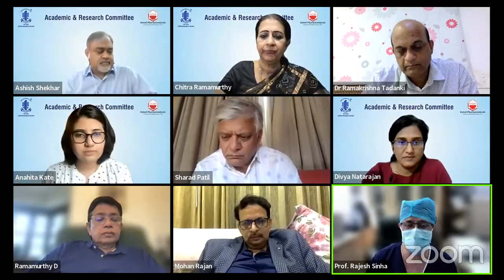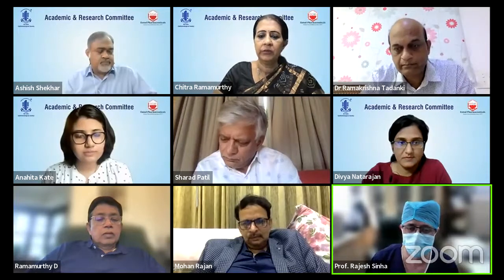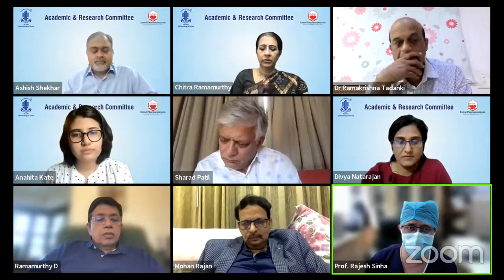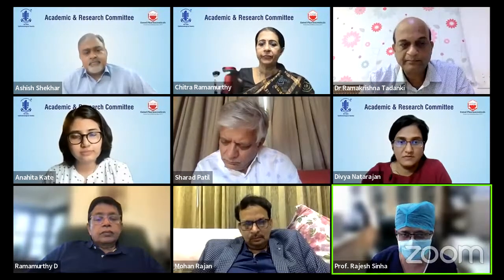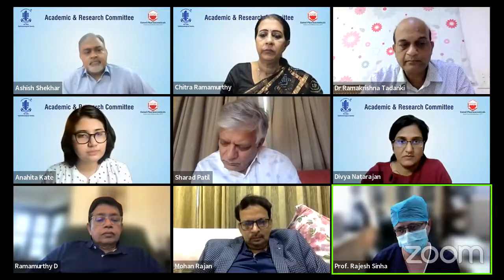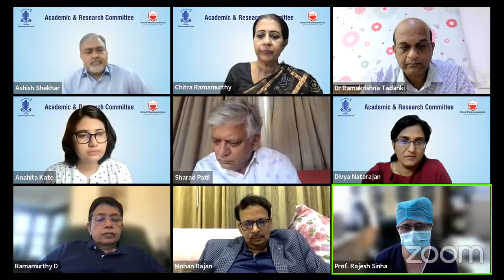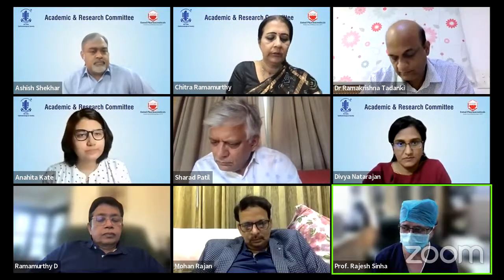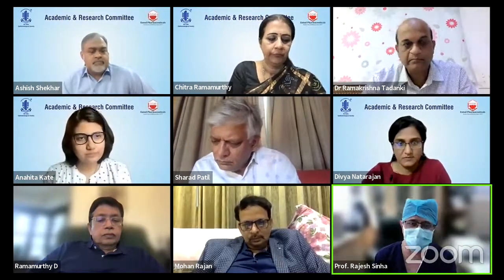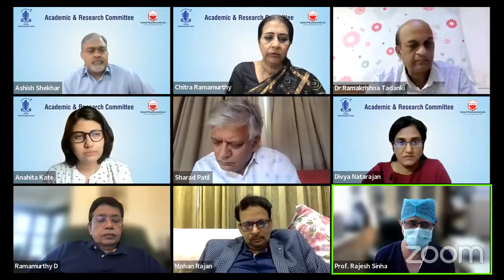It was a very nice presentation, very nice points mentioned. Just a couple of things that you told regarding toric. I would say that if it's a young individual and if there is any doubt that that person has to undergo keratoplasty later, then toric should be a big no. If it's a senior citizen and the graft is absolutely clear, good endothelium, then only one can think of a toric IOL.